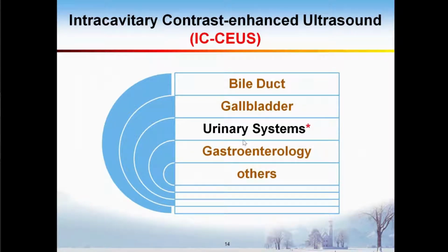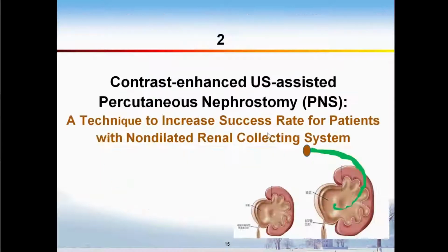And next, I'd like to move to the urinary system, focusing on contrast-enhanced ultrasound-assisted percutaneous nephrostomy, PNS. The technique is to increase the success rate for patients with a non-dilated renal collection system.